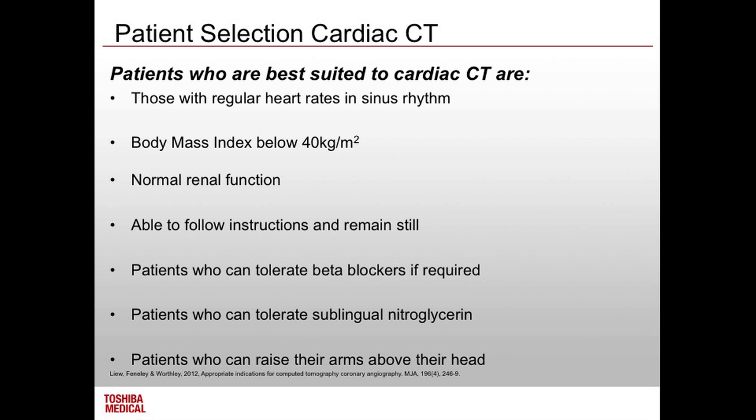So nitroglycerin is important. However, some people can't tolerate it. And the other thing is, there's been heaps of stuff, and I'm not sure what we actually say now, but we used to give nitroglycerin and scan straight away. Then we went to a 5-minute delay, and now I think it's out to about 7 minutes, but that seems to be ever changing. The patient, if you give too much, will get a headache as well. So it's a good idea to warn them of that so they don't freak out and say, oh, I've got a headache after the scan, and just say that's normal, take some Panadol or Nurofen, whatever you usually take for a headache, and it should treat it.